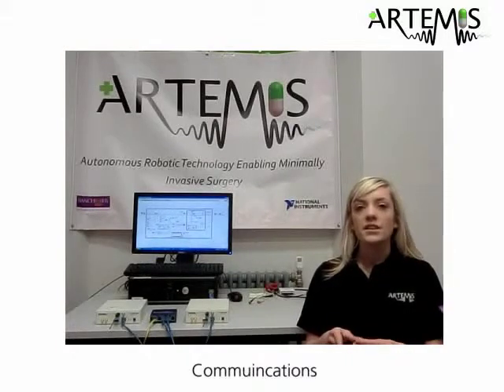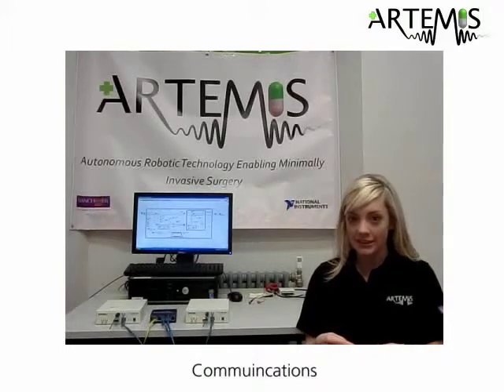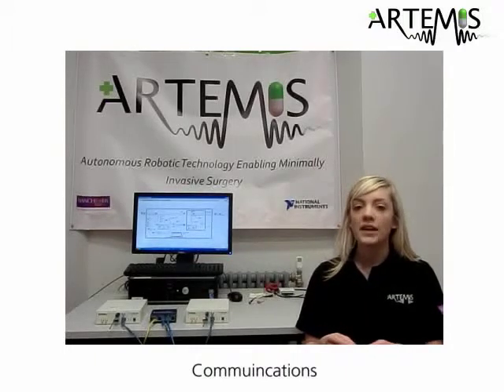Research also told us that the lower the frequency, the less the attenuation that would be caused by human tissue. If we designed our own bespoke communications link, we could reduce the distance and data rate, which would hopefully provide a power saving, and could also choose a lower frequency to reduce the degradation of the signal and hopefully improve the bit error rate. To design this bespoke link, we had to choose both a frequency to operate at and a modulation scheme to modulate the data to the desired frequency.